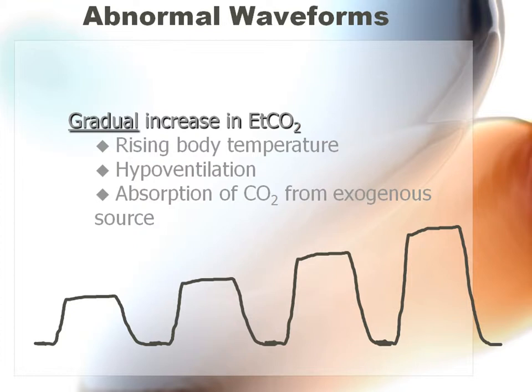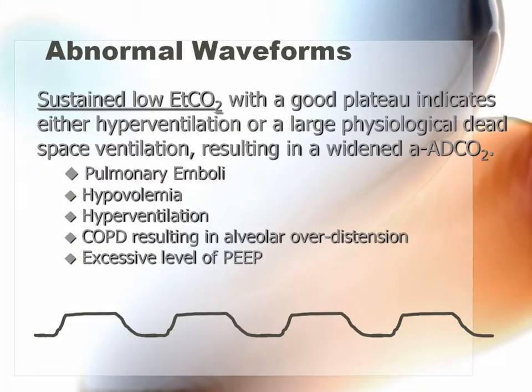The other thing they found out is, during cardiac arrest, let's say you have an end tidal of like 25, and all of a sudden you'll see a spike come up. After that, pulses will actually start coming. That's because everything's starting to work again. Now the pump is trying to catch its way up. We actually feel a systemic pressure.